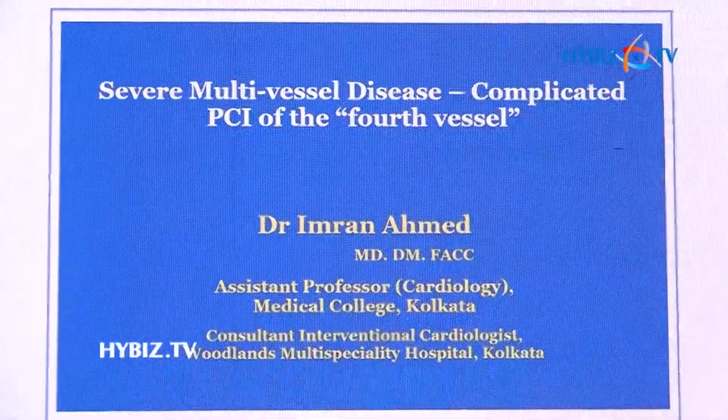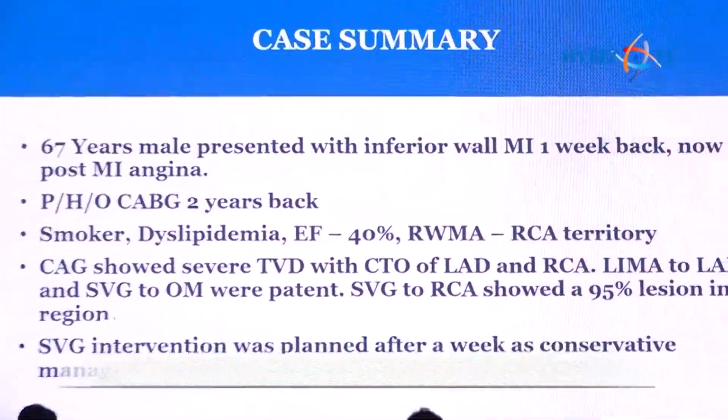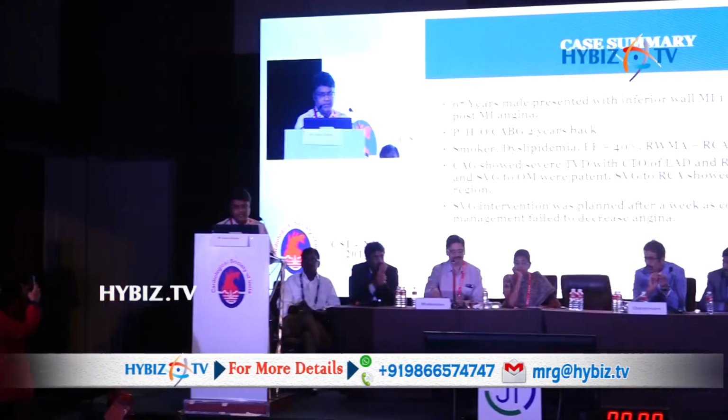This case is regarding an SVG intervention. It's a slightly different ball game than coronary artery PCI. This was a 67-year-old male who presented with an inferior wall MI 1 week back. So he presented 1 week back after an MI to us with angina. He has had a CABG 2 years back.